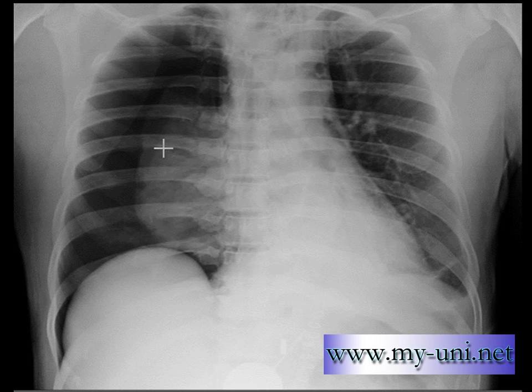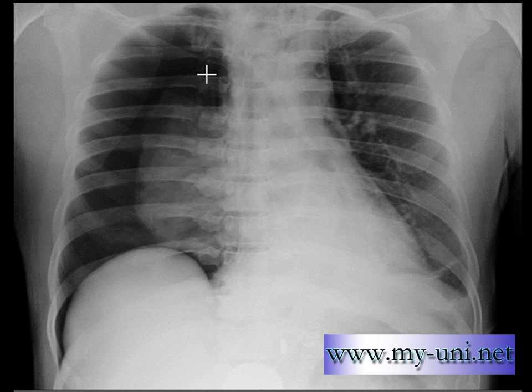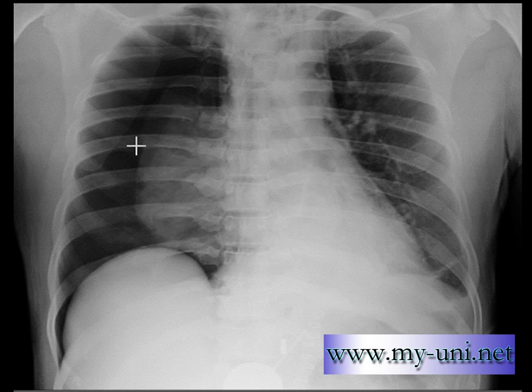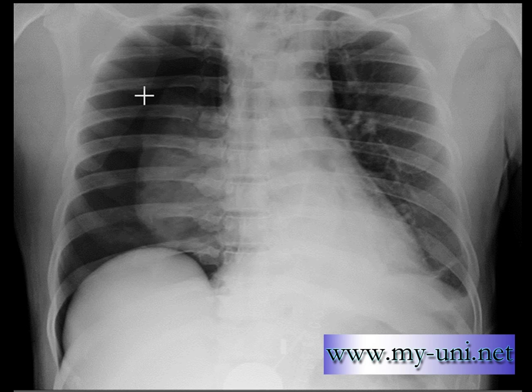You can see right collapsed lung in this area. You can see air density beyond the visceral pleura — the visceral pleura should not be visible on a normal chest X-ray. The reason I believe this is a collapsed lung and this is a pneumothorax is because you cannot see vascular markings beyond this line.